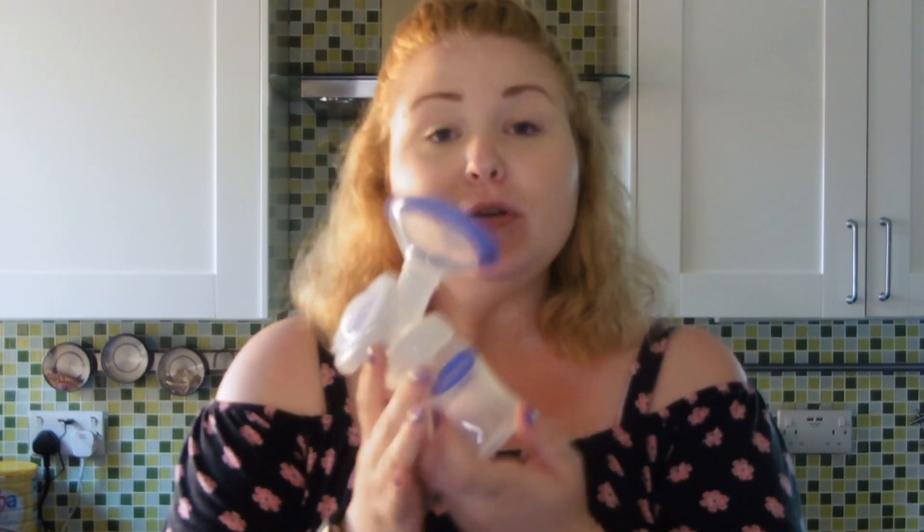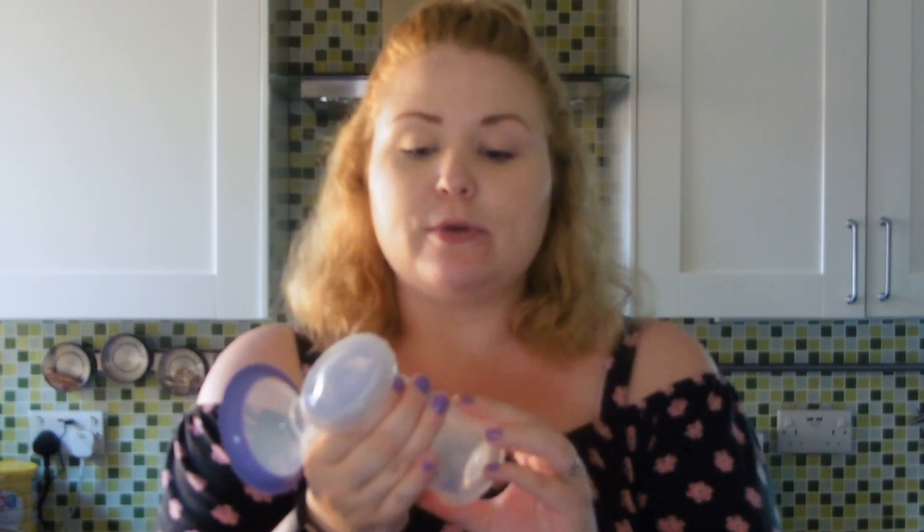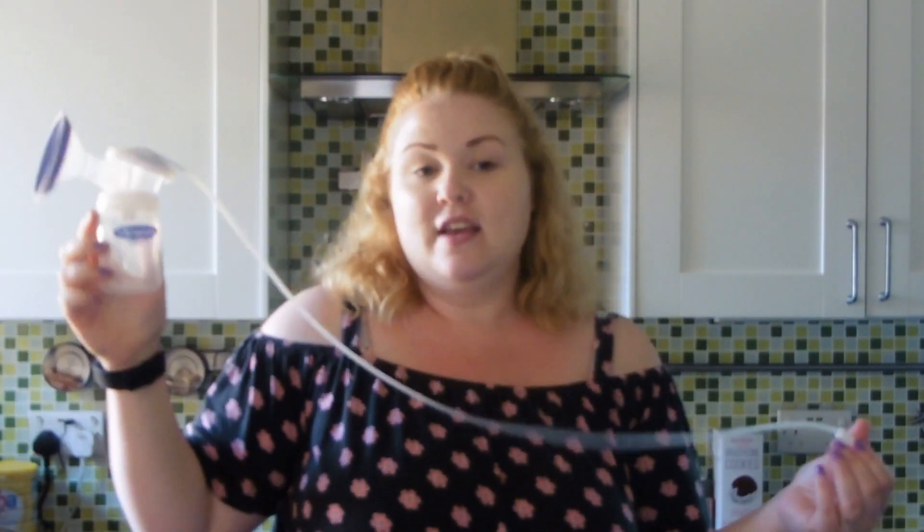The bottle that comes with it is one of the Lance and O bottles and you've got your ounces along the side. These are the bottles where you can also screw on the teat and the top bit so you can feed directly from the bottle if need be. Or you can do what I do — pump into the bottle, open it up and pour it into the milk storage bags that Lance and O also do. You also have a super long connector that connects the bottle to the pump itself, which means you don't have to sit extremely close to it and it gives you a bit of breathing space to move around whilst you're pumping.